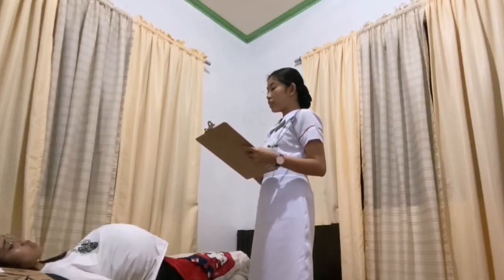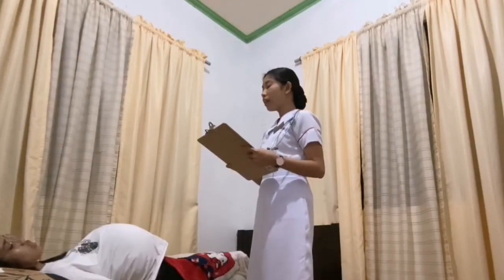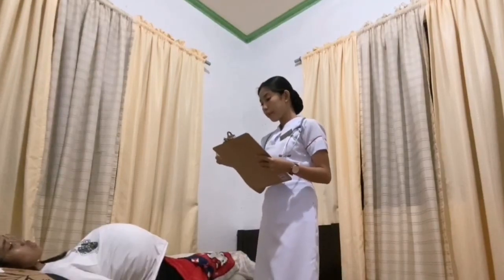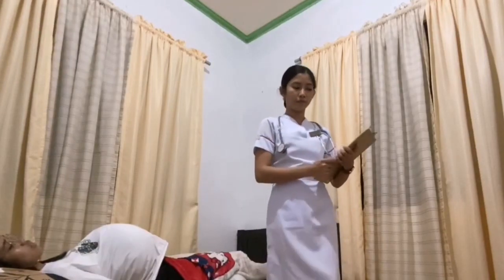Then, as for the FHT, it is 140 beats per minute. So, all in all, the baby po is normal and healthy. That would be all.